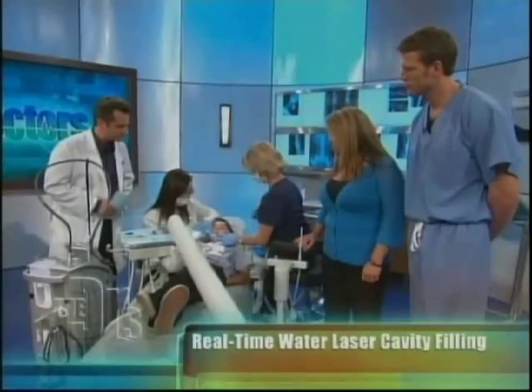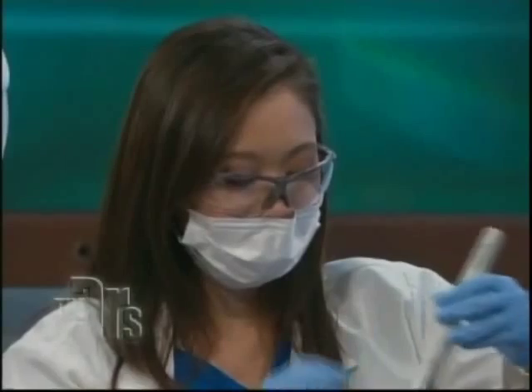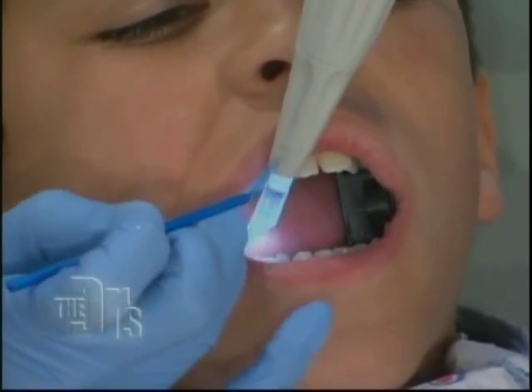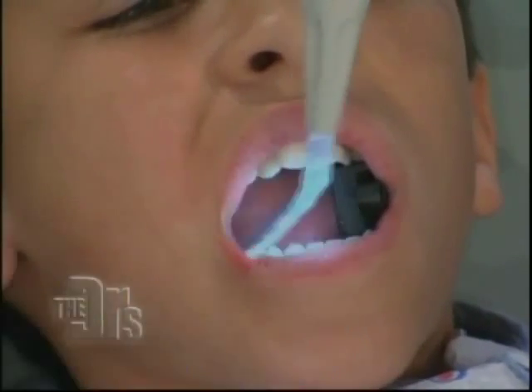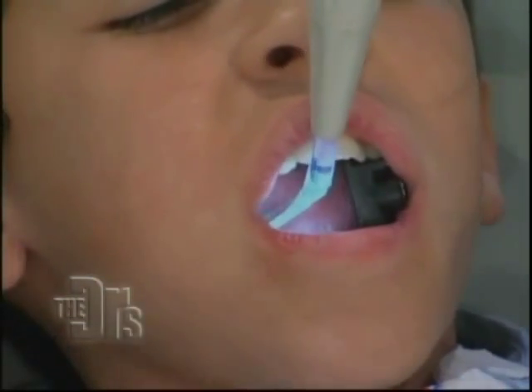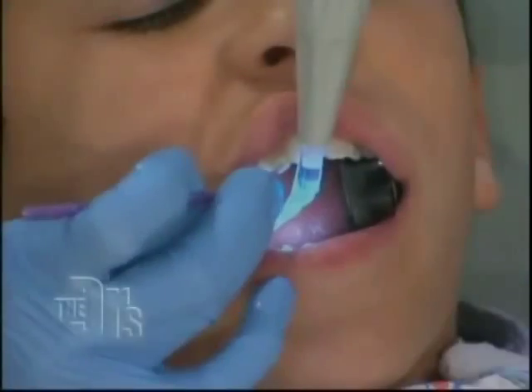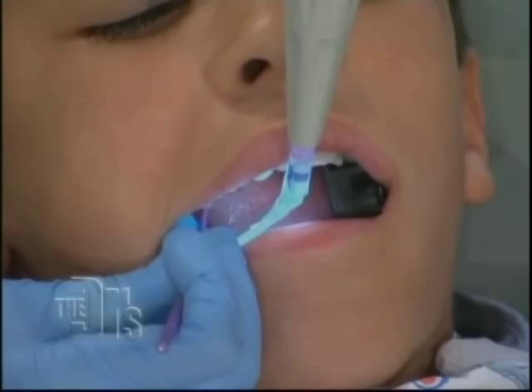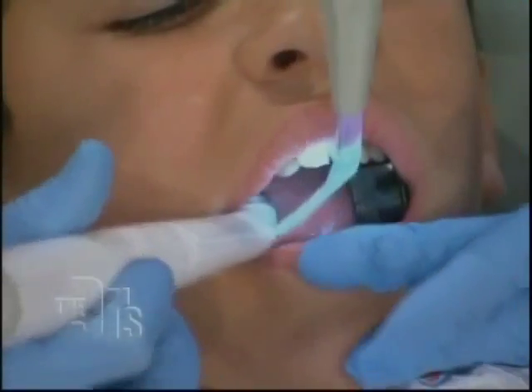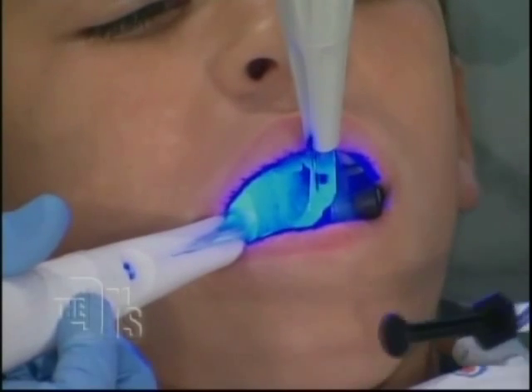We leave the etch on just for a few seconds, and then we go ahead and rinse. The second layer of tooth material we're going to use is called the prime. The prime prepares the tooth structure to receive the composite resin. In the past, dentists used a lot of material called the silver filling — that amalgam, the old, ugly silver fillings. Now we're priming it. Then we go to the second layer, which is called bond. Bond is the layer — like glue — that attaches the composite resin to the tooth structure. We also have something called the magic light. It's a blue light, and it hardens the tooth surface. Once we put our composite resin in, it starts off as a putty material, very liquid-like, and then with the magic light, it hardens it up.